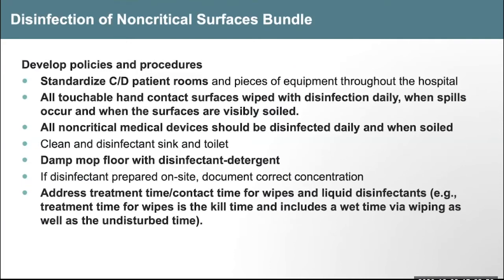Okay, so what do we all need to do? Standardize cleaning and disinfection of rooms throughout the hospital. All touch surfaces should be wiped with disinfectant daily, when spills occur, and when visibly soiled. All non-critical medical devices that are shared between patients should be disinfected daily and when soiled.